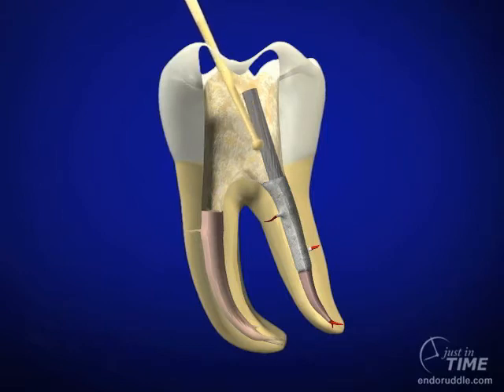Once the buildup has been completely eliminated and all the materials have been removed between the axial walls and the post, we can begin thinking about ultrasonics as the first line of offense for successful post removal. Cliff's 10-minute rule means we can only vibrate on a post so long, and it's either going to loosen and be eliminated, or we'll need to have another fallback strategy.